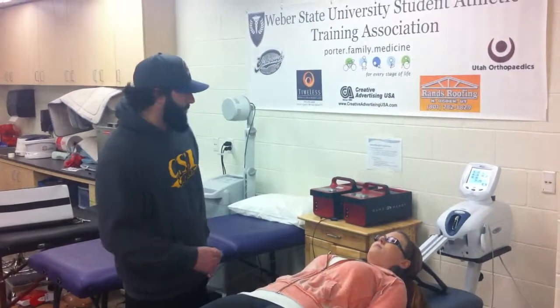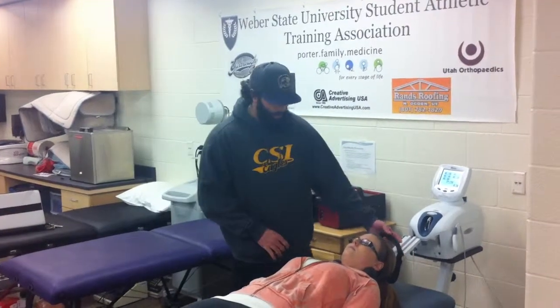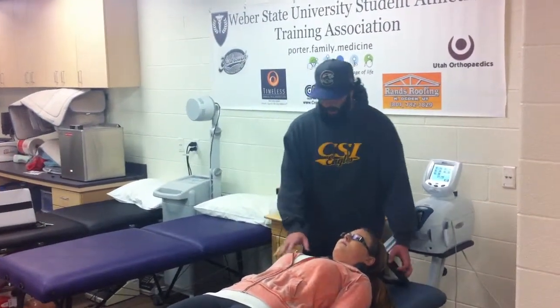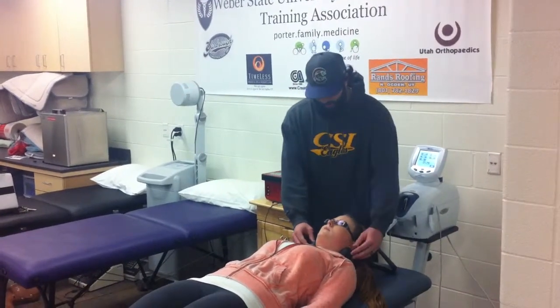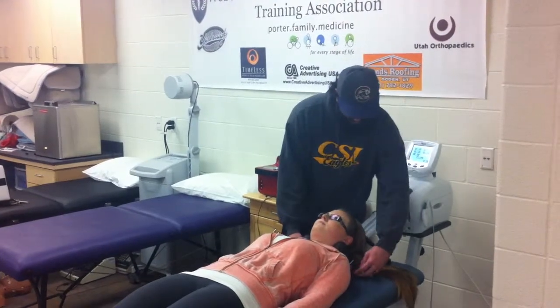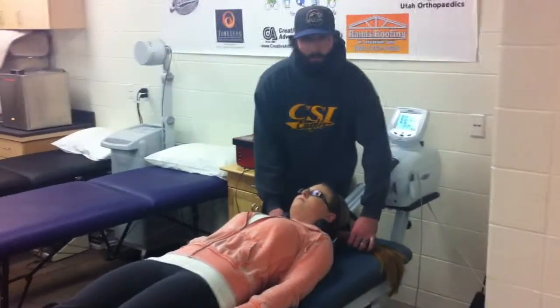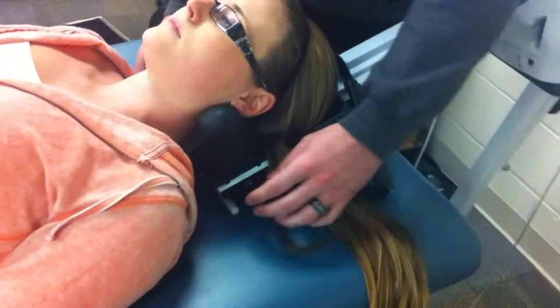Our modality is cervical traction, motorized cervical traction. We've got our patient in supine. Once we've got them on the table, we want our pads to be touching the styloid process or the mastoid process. We can rotate these in or out to make the patient more comfortable. We'll just have them let us know when it's comfortable for them.